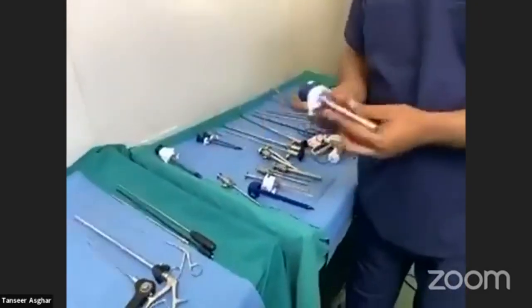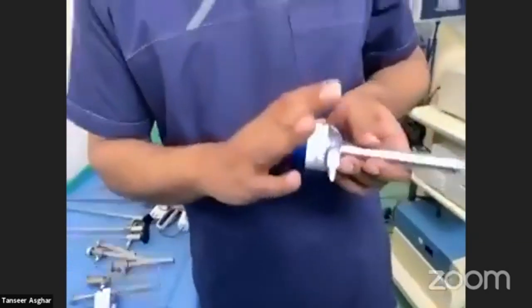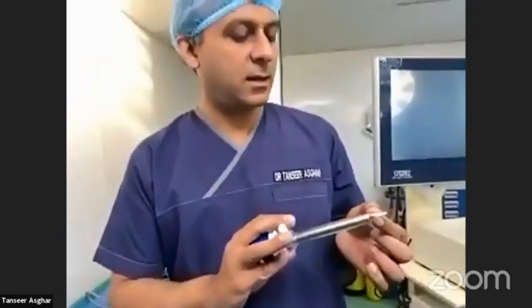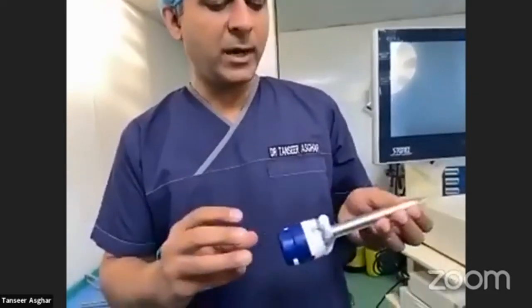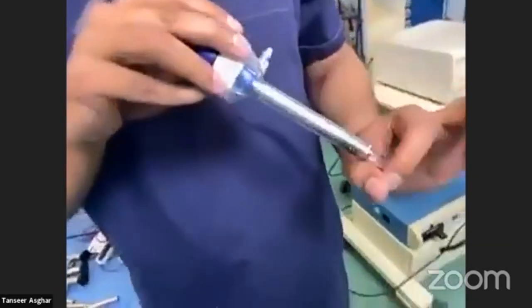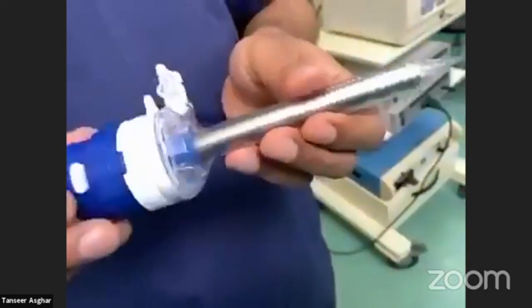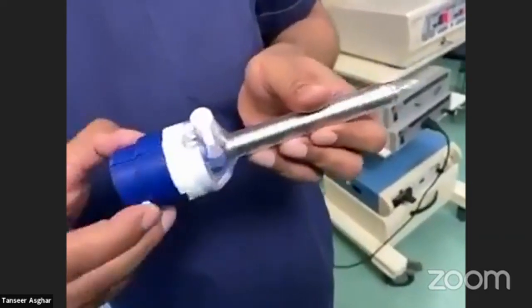Coming on to another trocar — this is another disposable optical trocar, or optiport. You can put the camera telescope inside and visualize the muscles and different layers of the abdomen being cut as you advance. The rest of the mechanism is exactly the same.